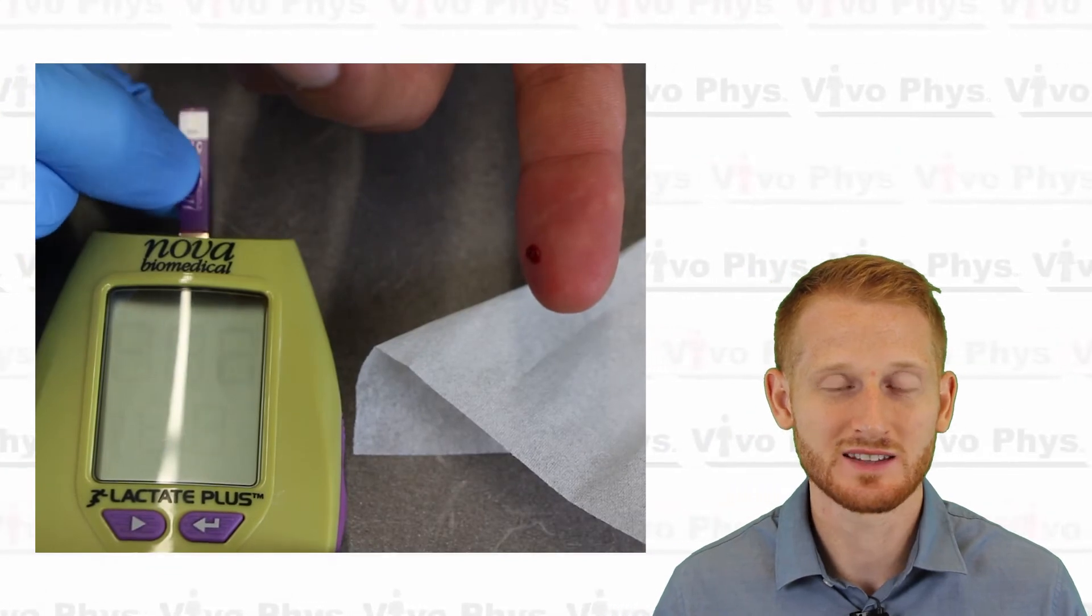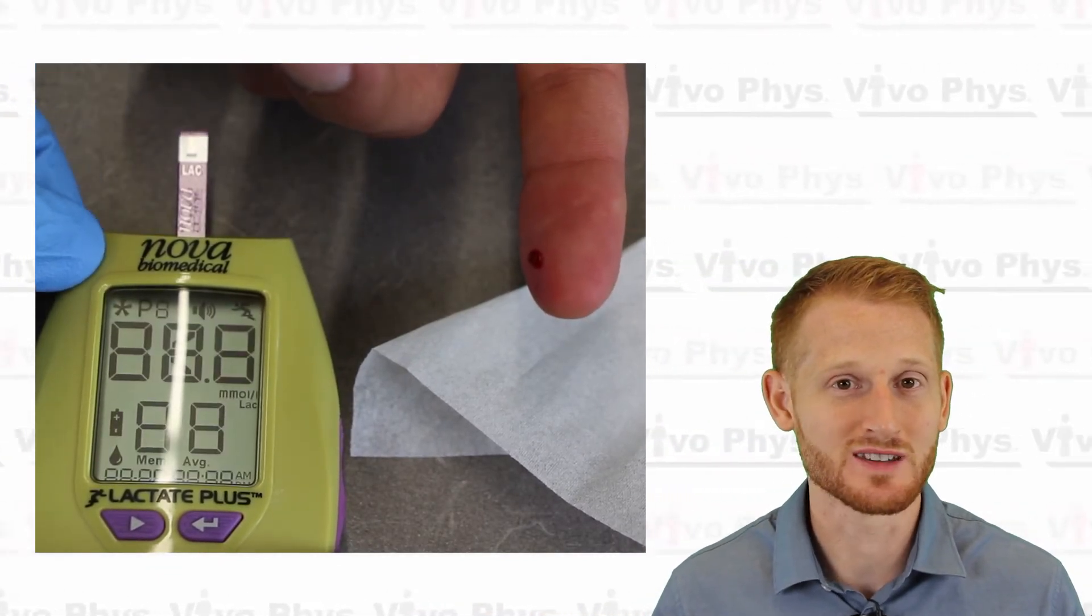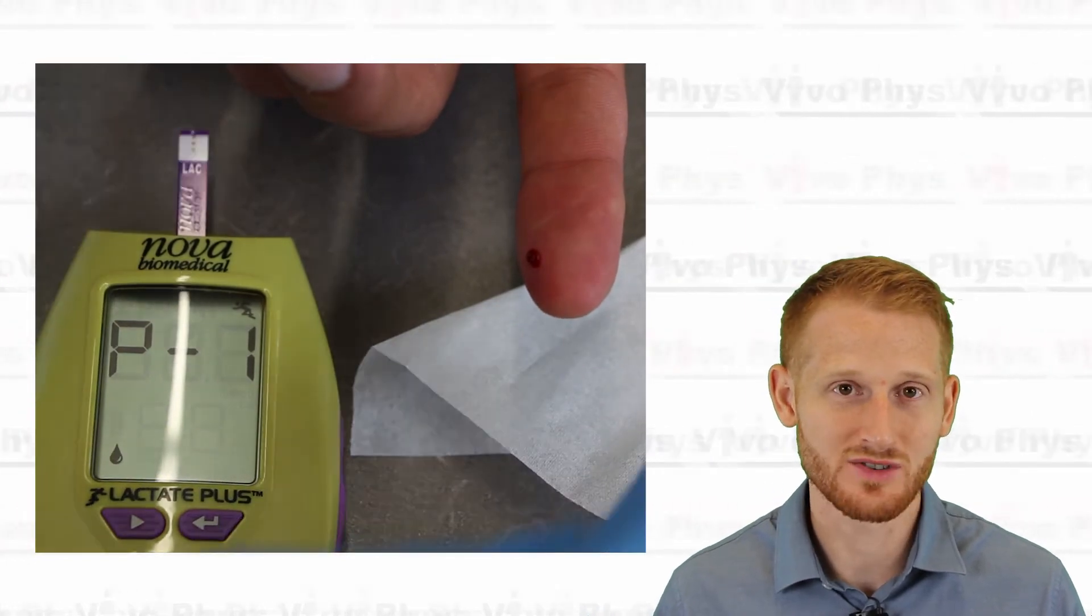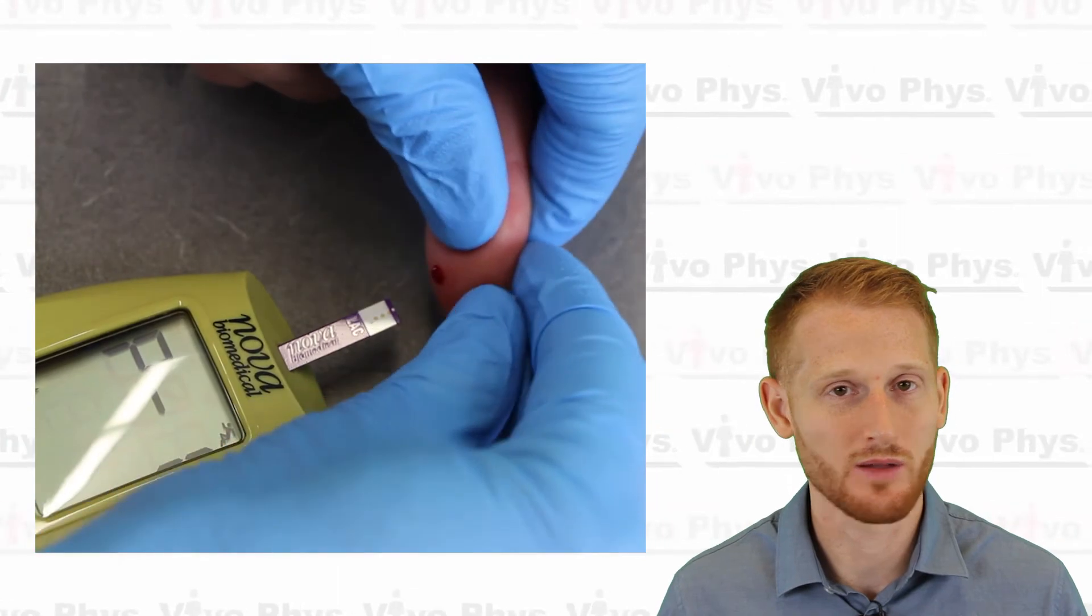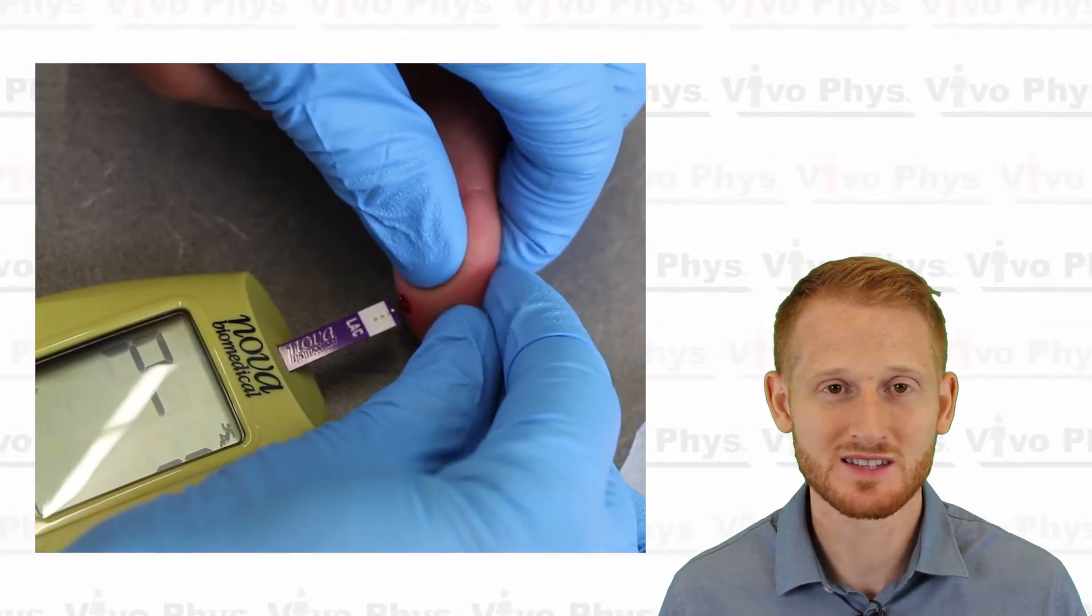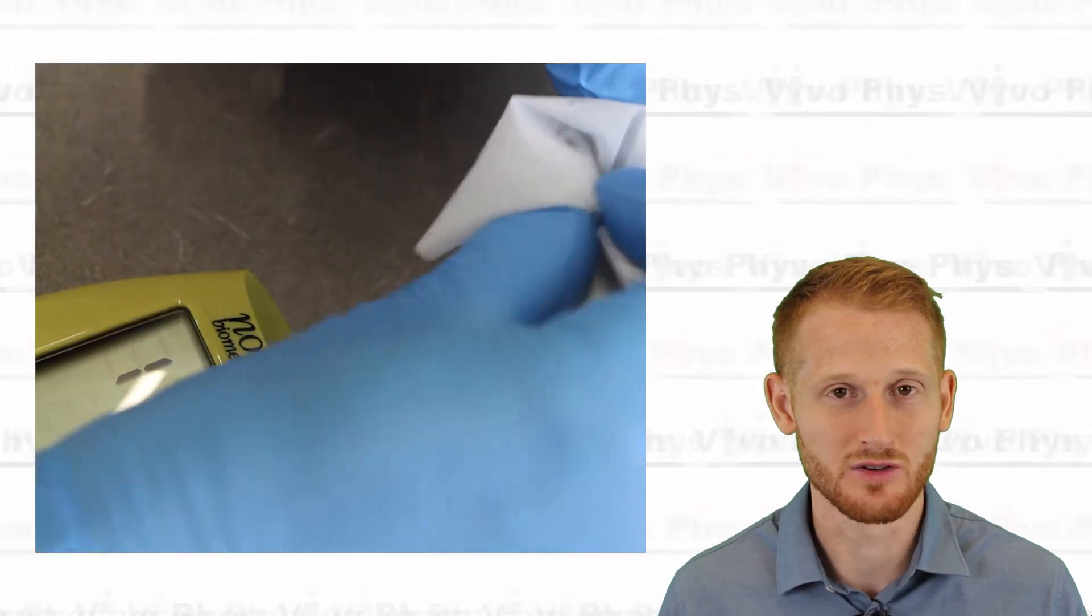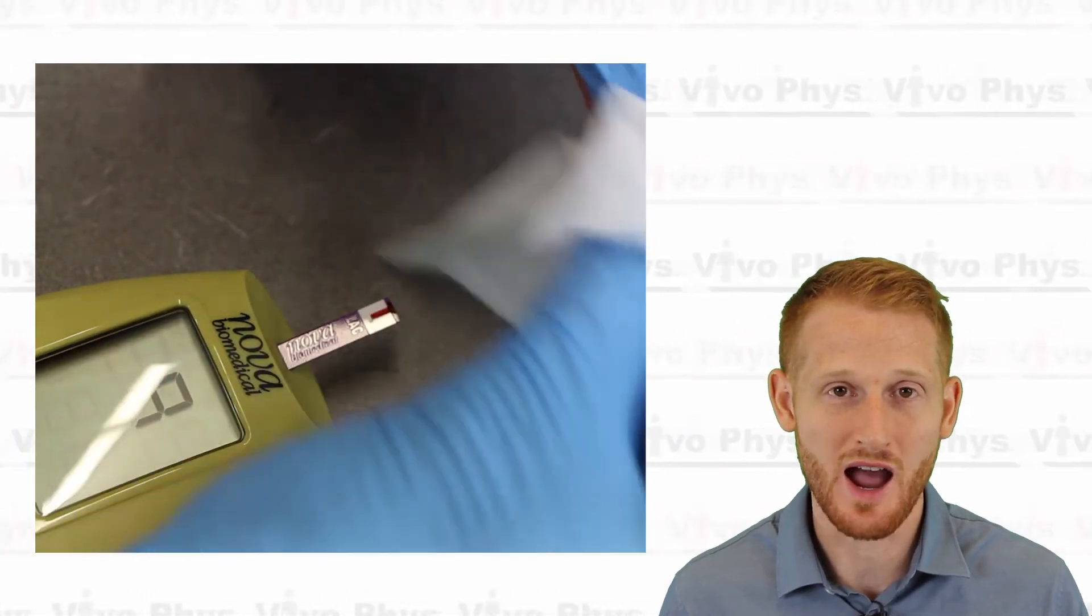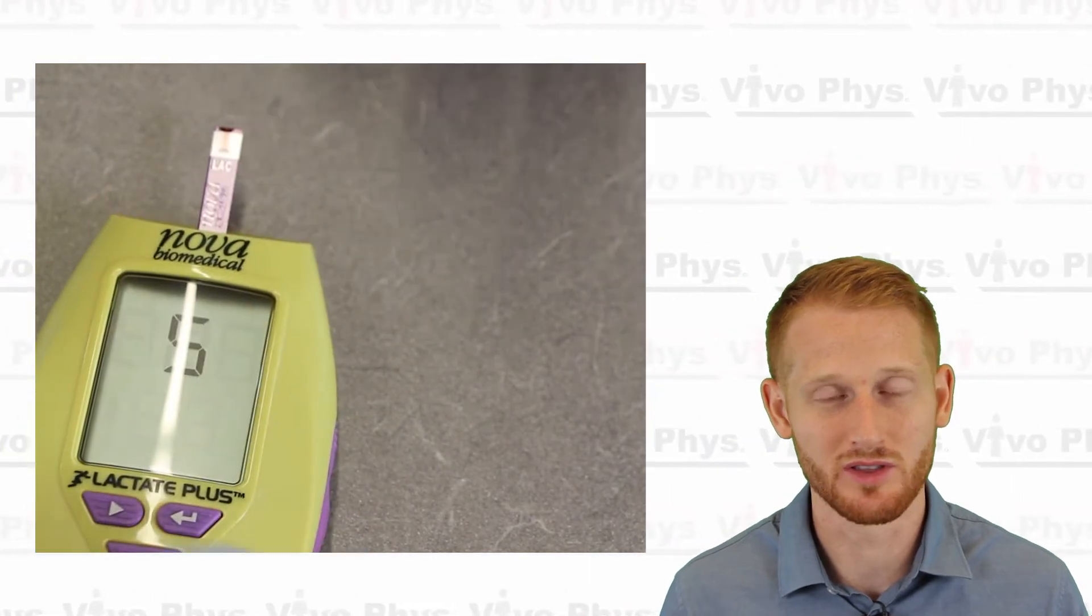Once you place it into the lactate analyzer, you're going to see that the screen turns on and that tells you that it's ready to be used. Once that screen is on, you do need to use that lactate strip within probably about 10 or 15 seconds. Otherwise, it's going to either turn off or deactivate. So make sure that you put the strip in after you have the drop of blood ready and that you immediately put it in contact with the drop of blood.